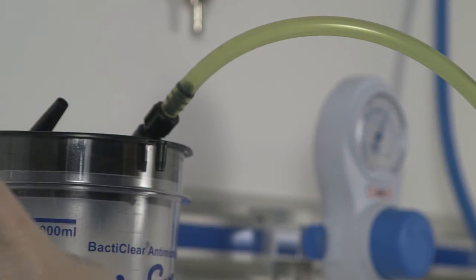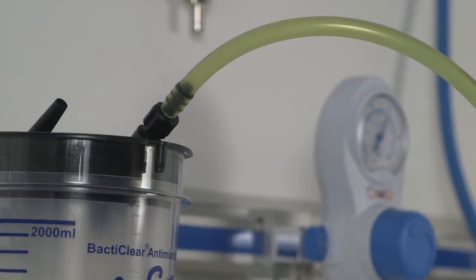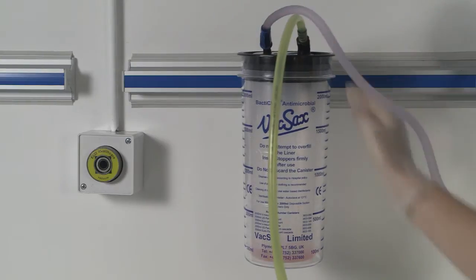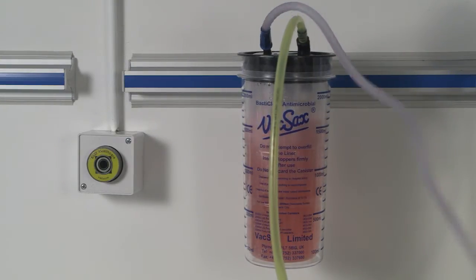Place your finger over the patient port located on the lid of the liner, ensuring a vacuum is present. Connect the patient tubing to the patient port located on the lid of the liner. The unit is now ready for use.